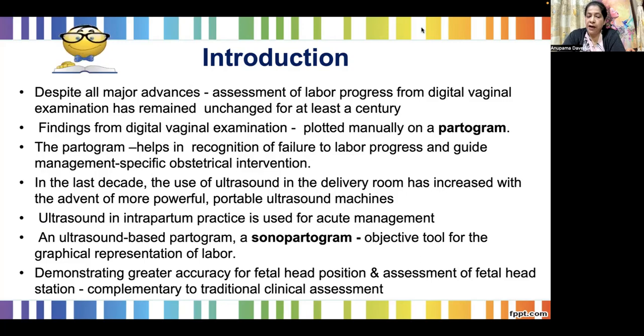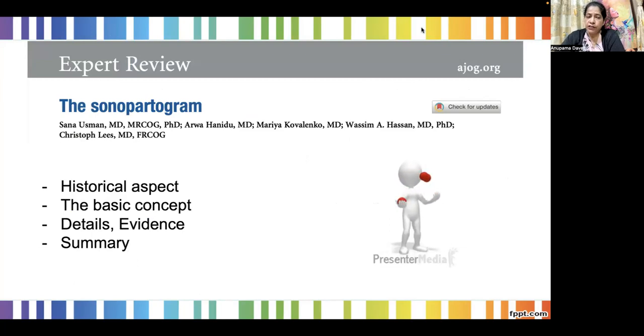It is the sonopartogram and is an objective tool for graphical representation of labor. This demonstrates greater accuracy for ascertaining the fetal head position, for assessment of fetal head station, and is definitely complementary to our traditional clinical assessment. The details of my talk I've taken from American Journal of Obs and Gynae, and it would be reviewed under these following headings: historical aspect, the basic concept behind sonopartogram and details, whatever evidence we have for it, and summary.